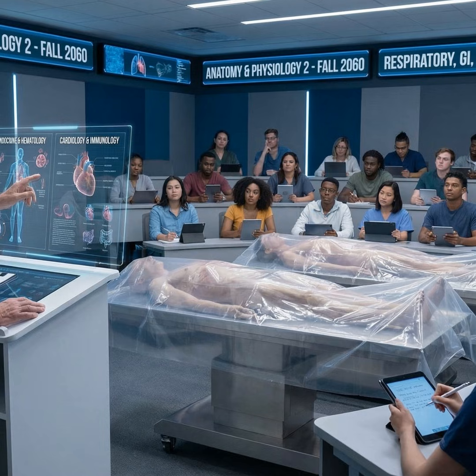Okay, here we go. Step 1. The ratio is 55%. That's less than 70%, so bam, it's obstructive. Step 2. The loop is scooped out, which just confirms our obstructive pattern. Step 3. The DLCO is low. And that is our tiebreaker. So a low DLCO and an obstructive pattern. What does that point to? It points directly to the destruction of the alveolar walls. And that is the textbook definition of emphysema. See how easy that was?